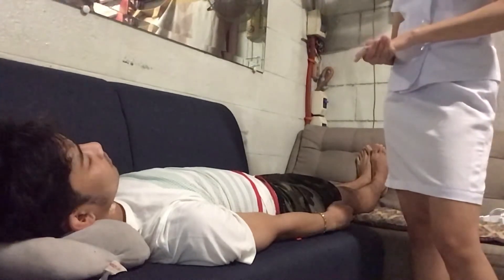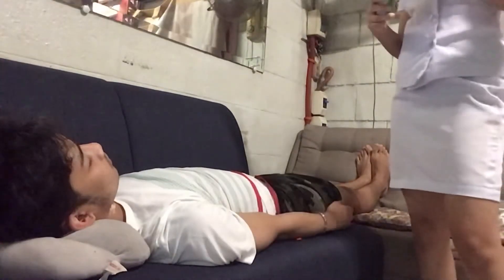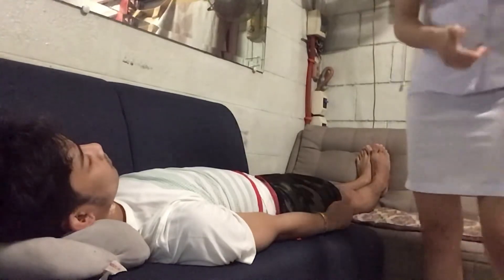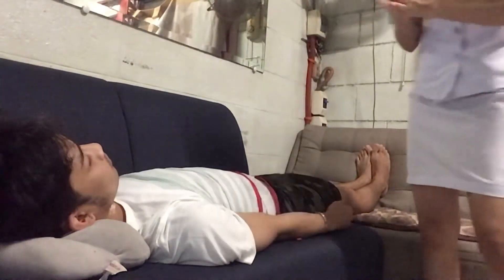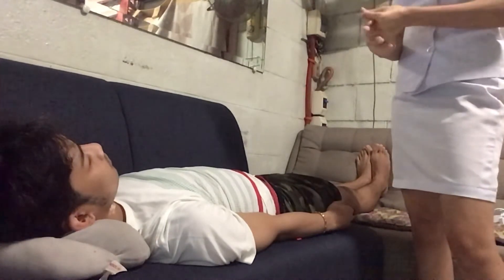Next, wash your hands and provide client privacy. When in a ward, close the curtain. When in a private room, close the door.